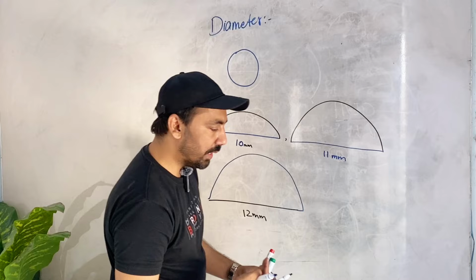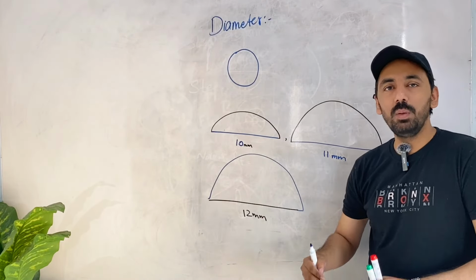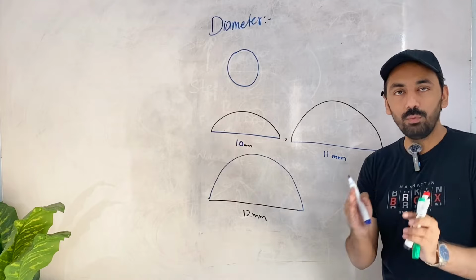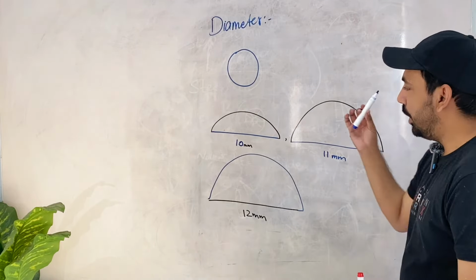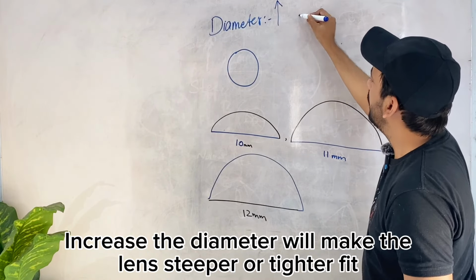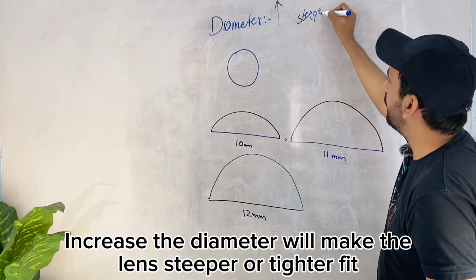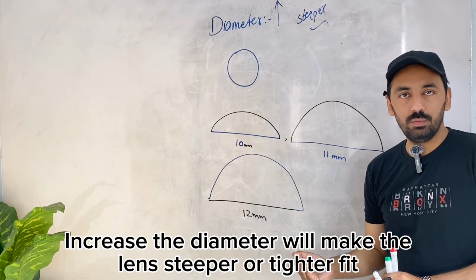You have to remember this key line: if I increase the diameter, the lens will be more steeper, a tighter fit.